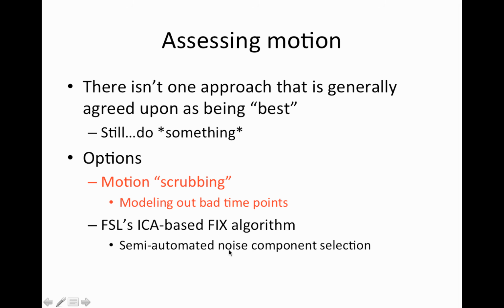We're going to use motion scrubbing. And again, nobody agrees which one of these is better. And I haven't seen anything that's super convincing one way or the other. Basically anyway. But if you do something, it's better than nothing.